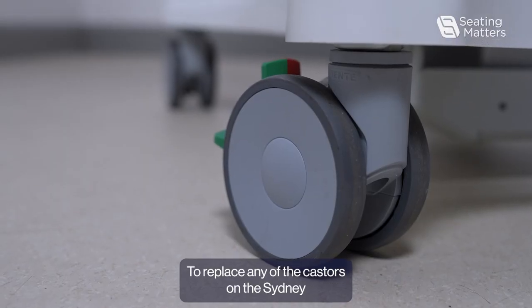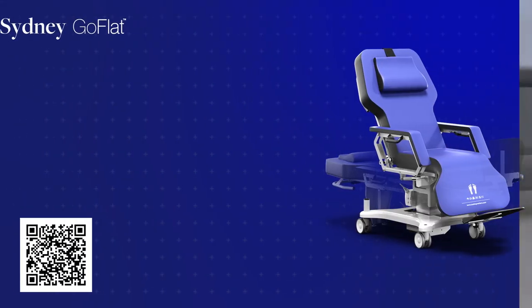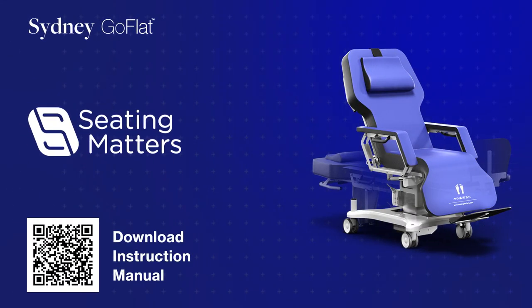To replace any of the casters on the Sydney, we follow the same procedure. Make sure you repeat it for each one.